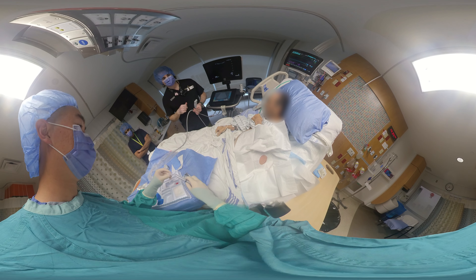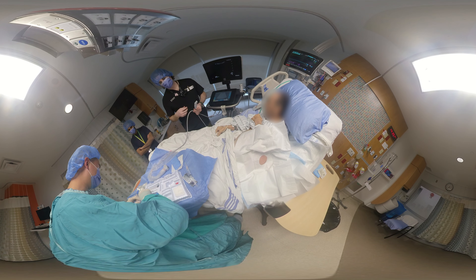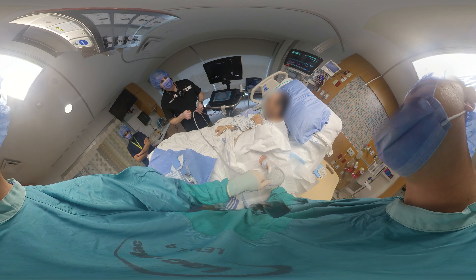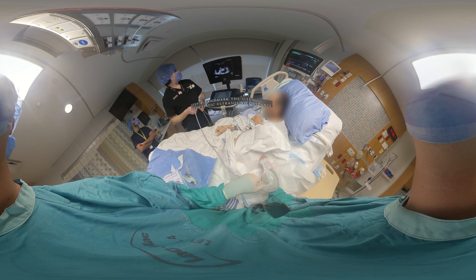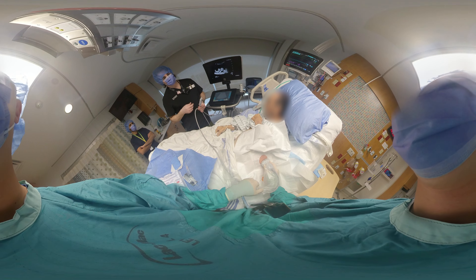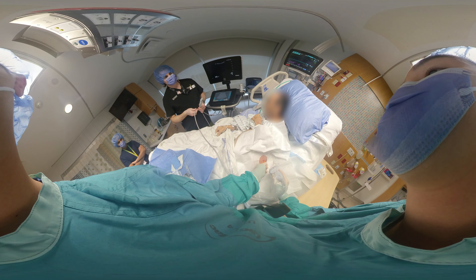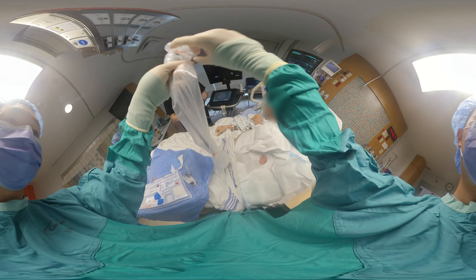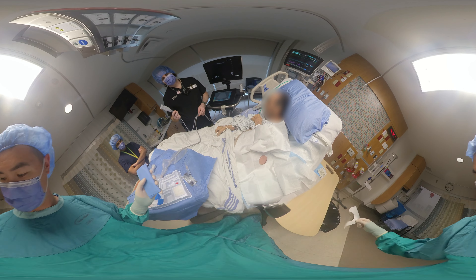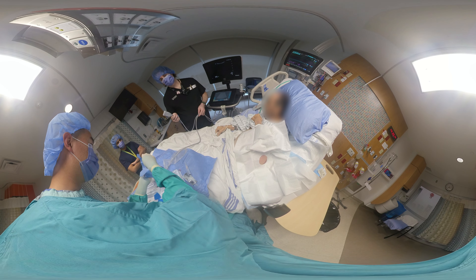We'll draw up some 1% lidocaine. Usually, freeze the area first, and when you freeze the area you can go in far enough to draw up some peritoneal fluid to make sure you're happy with the track. Mark the spot using the ultrasound probe to find the easiest and safest area to access, then use the hub or back of a blunt cannula to mark the entry spot. This is a static ultrasound technique rather than an ultrasound-guided technique.